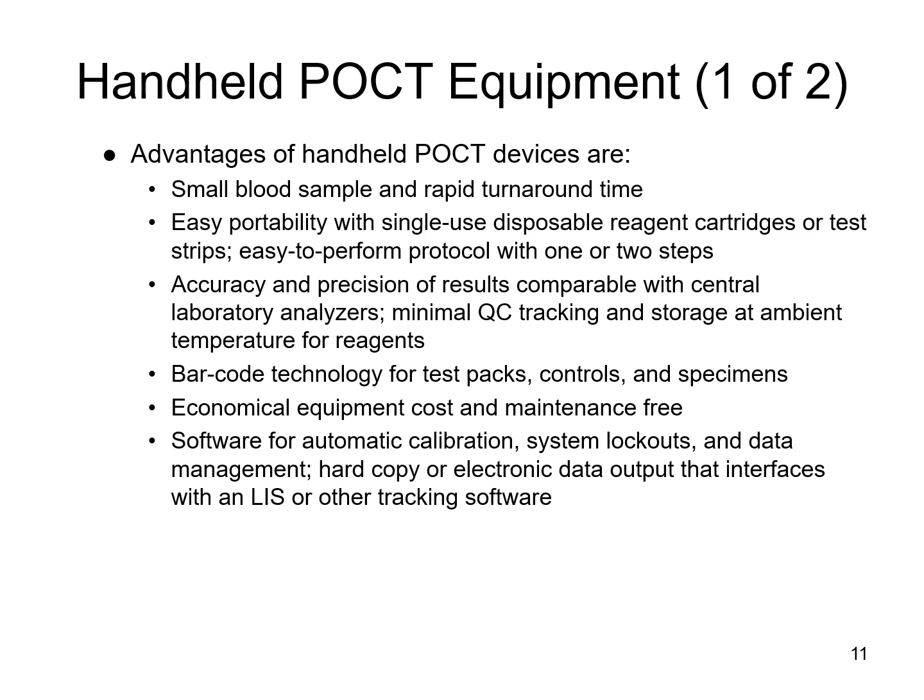If you were to run controls on it, you have the capability of scanning those as well. The cartridges used with these various handheld analyzers usually have some sort of computer chip or barcode on the cartridge itself so that it helps identify what the test is that you're about to perform.